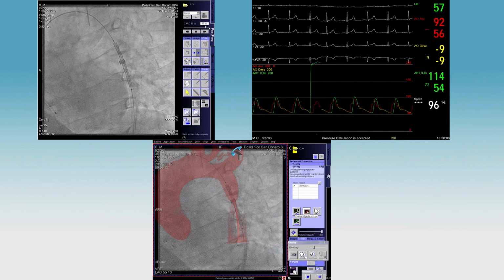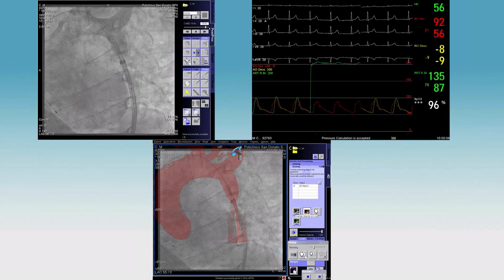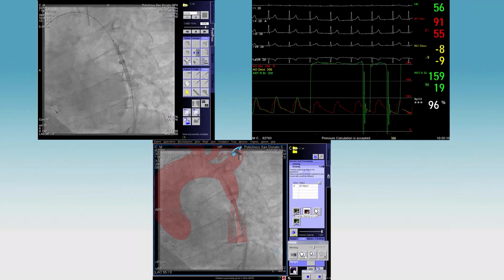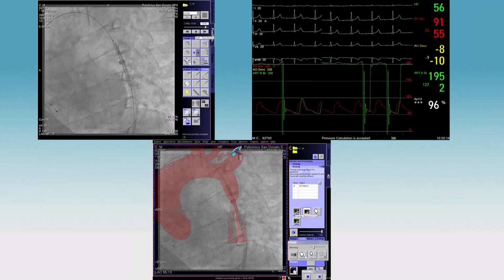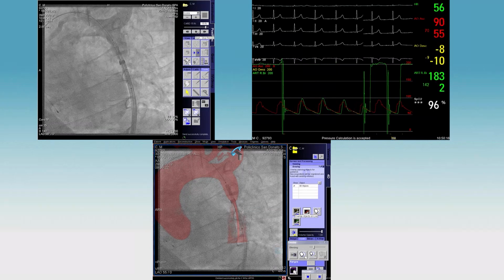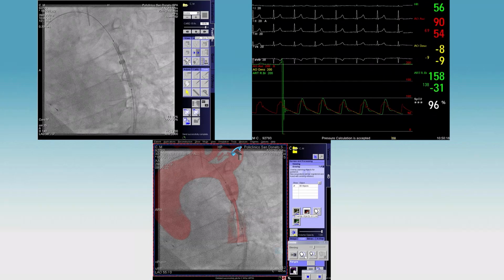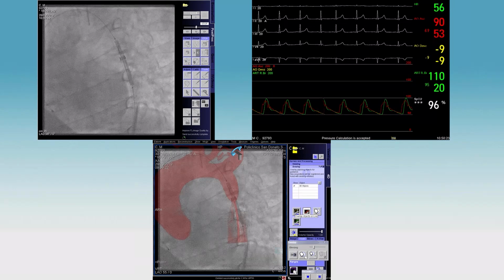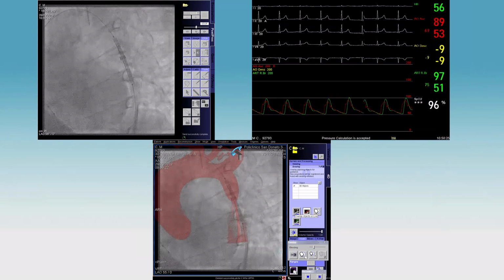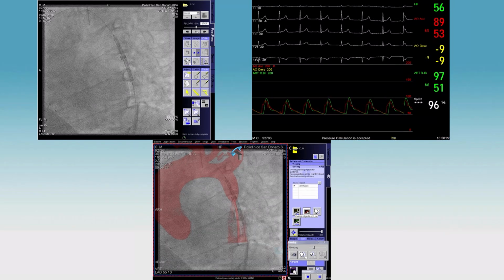Yeah, I think that looks great. Maybe just a tad up, 2 or 3 millimeters. Yeah, that looks nice. The wire isn't distorting it too much. Right, stent up 2 or 3 millimeters. Yeah, that's it. And then if you keep the stent there and withdraw the sheath.